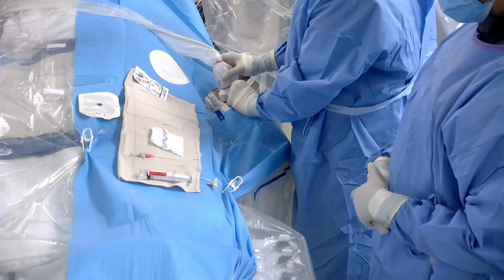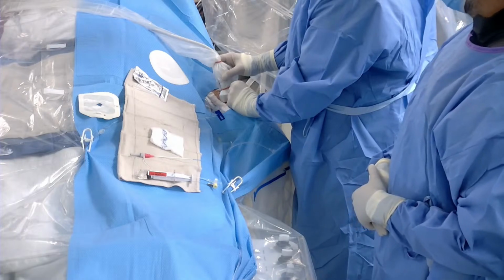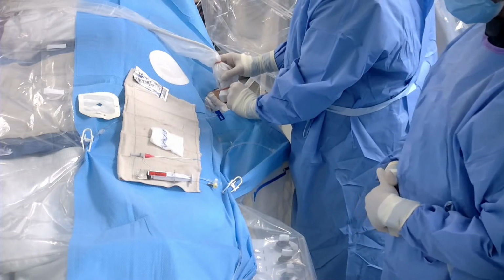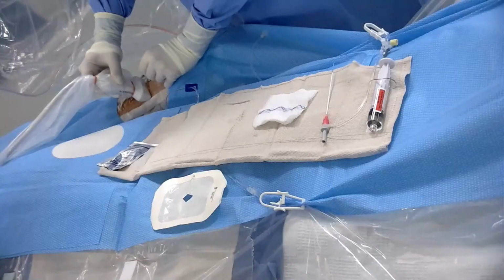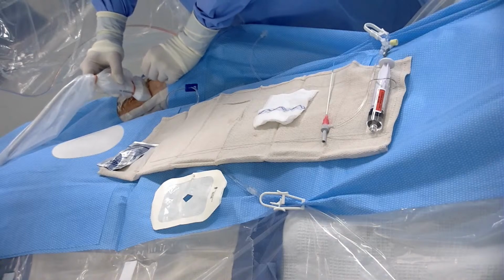It's also a little bit easier to get into the hypogastric from above. It used to somewhat limit what we can place, like it's a little harder to place an Amplatzer plug from the wrist, but it's easier for patient comfort. And they're going to have to go back into the groin shortly to put the limb extension in. So that's why we're doing it.